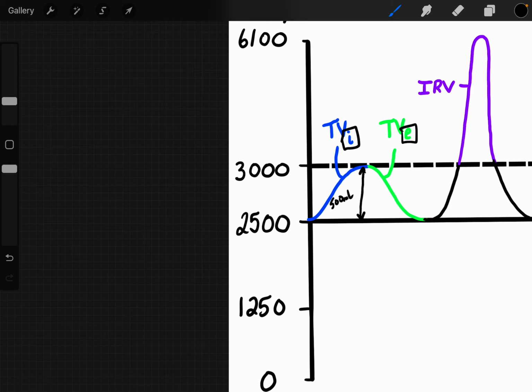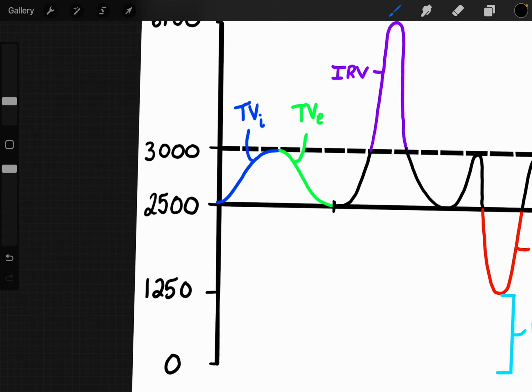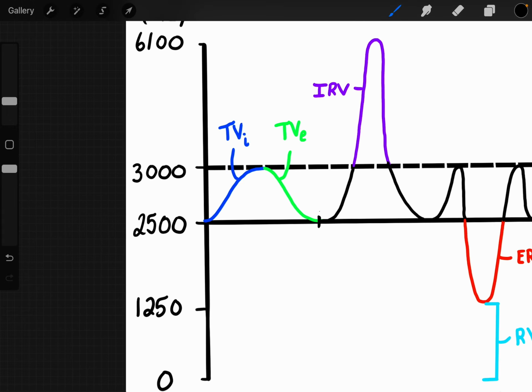Now, this is an adult patient, probably male, because you have a higher lung capacity in most male patients. As you look at females or children, you start to see slightly different values. But right here with the blue and the green, we're looking specifically at while you're just sitting around, breathing in and breathing out, not thinking about it, just doing it. Then as we move through the chart, starting at the bottom of the green, we take this normal breath in. That's what we're going up to.